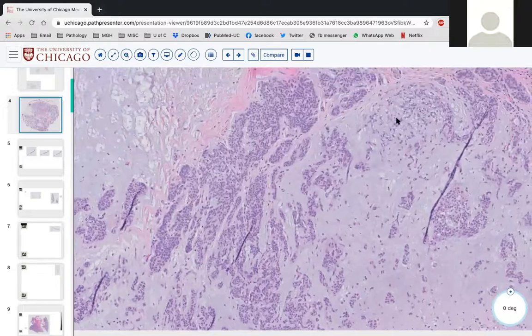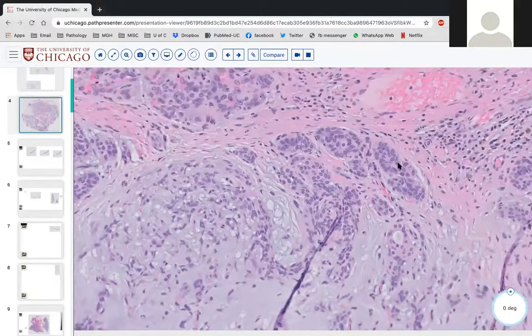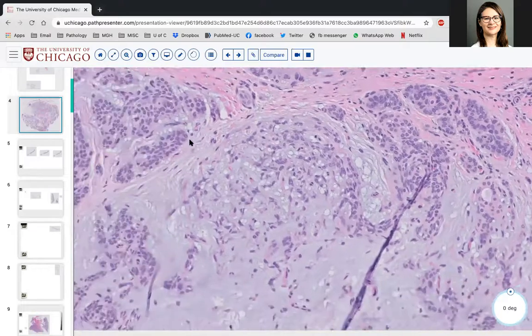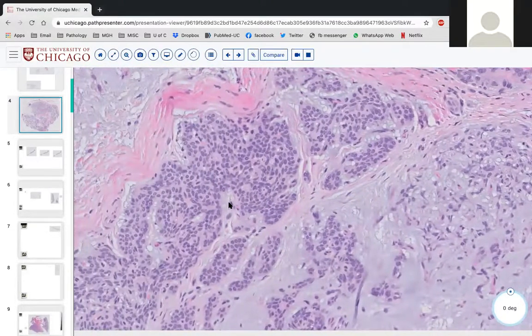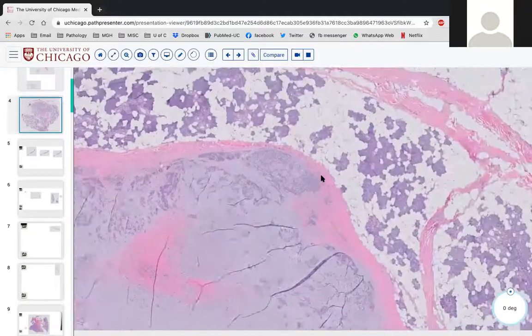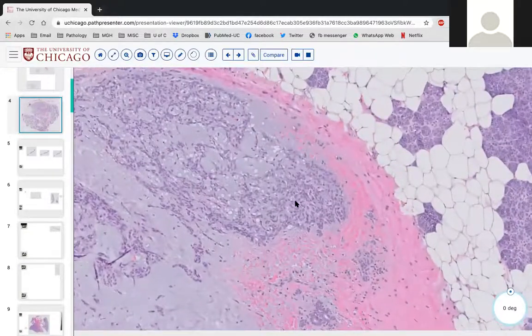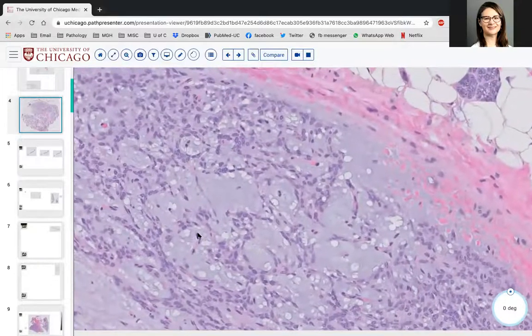I don't know, with that much mucin I just think of mucocele almost, but that looks different. I mean, you have your mucophages and everything. I know what I might do: P63 could help line the ducts, but I don't know what I would specifically be thinking of. Anybody else? Like a myoepithelioma?